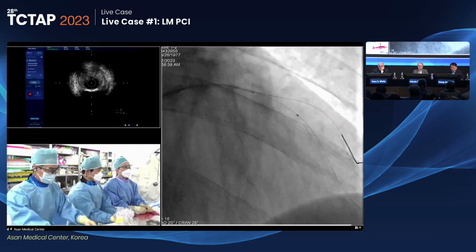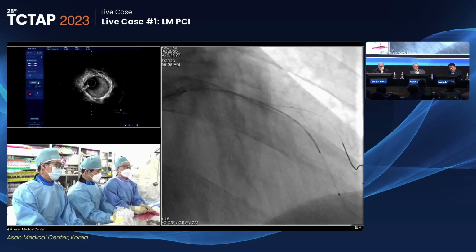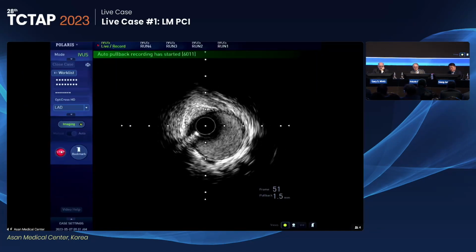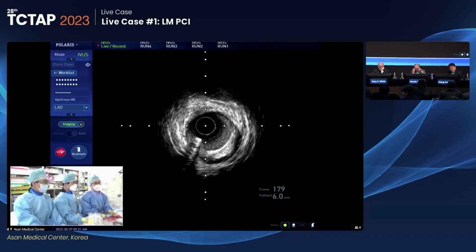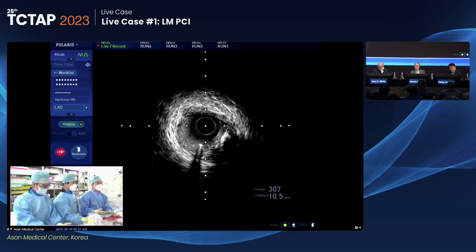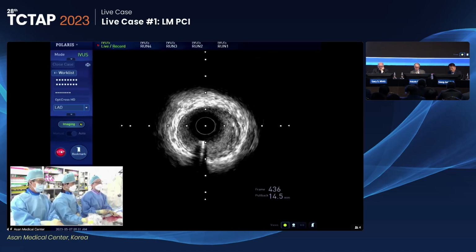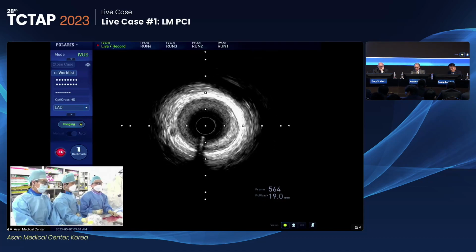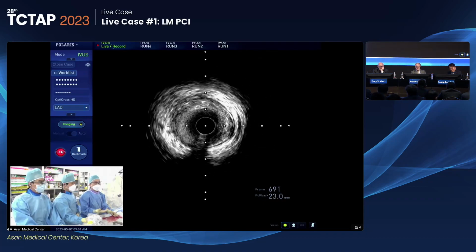But I have a concern about not covering the proximal region, because we are doing the procedure with many balloons and catheters and wires going through and may cause some damage, and I'm concerned about the progression of the proximal region. For the distal, I am okay with not stenting the distal region and putting the stent here with a shorter one. But for the proximal region, I have some concern about disease progression after the mid region procedure.